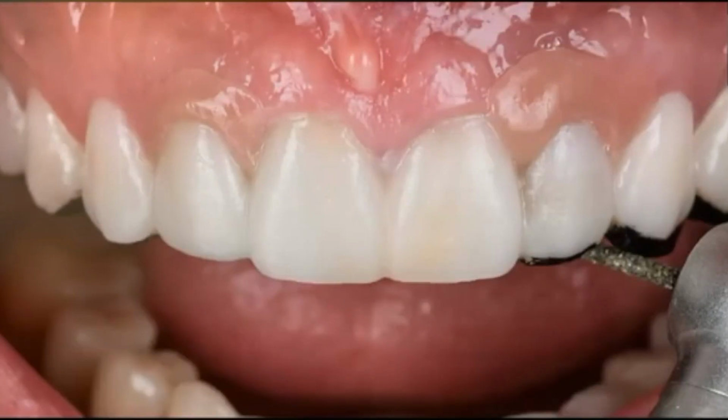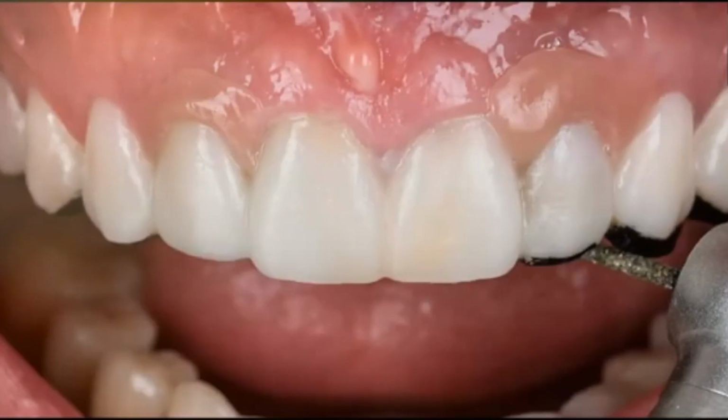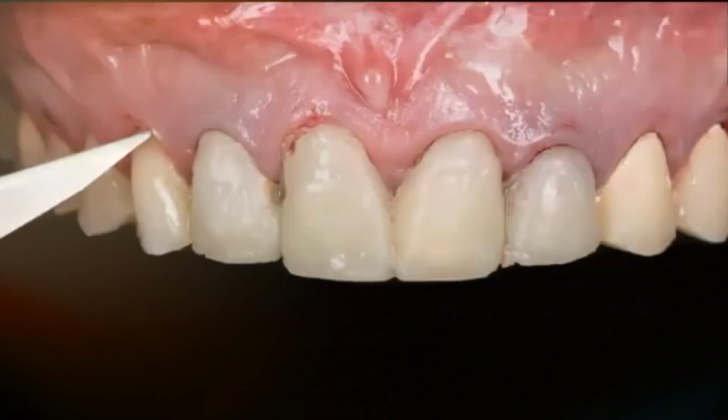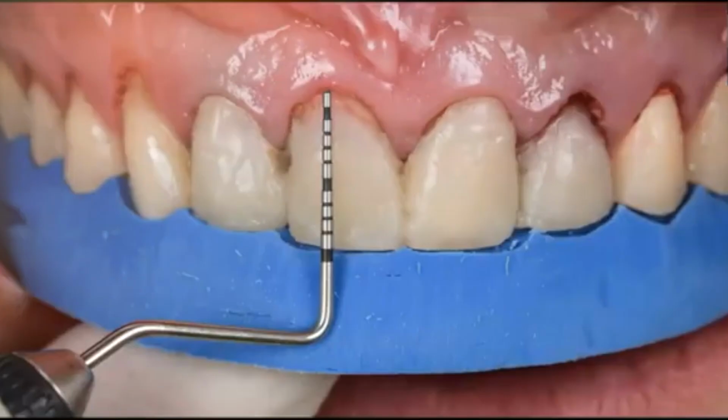So here again, once the patient accepts, we can go and cut the area that we painted with black, and then we crown lengthen according to the tissue. And then we restore the biologic width. We use a flapless technique here with an ultrasonic tip. Again, credits to Maestro Paolo Cano for this technique. It's amazing, simple, and very efficient wherever there's thin bone. And in our part of the world, most patients do not have a lot of buccal bone.